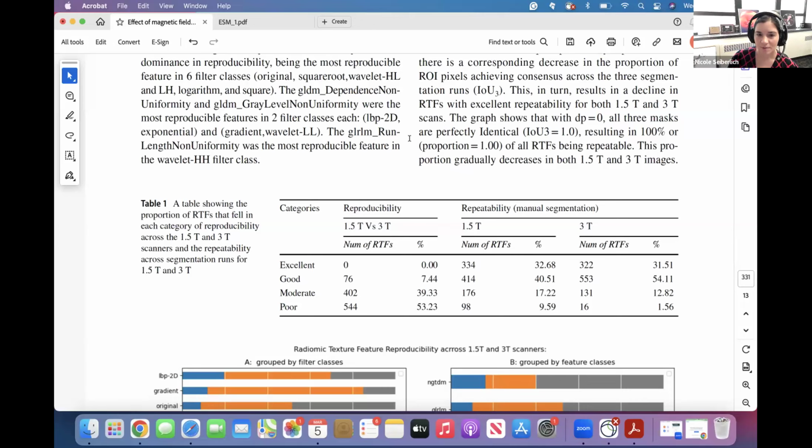So I think, just to make sure I'm understanding, the question is about the actual values, that the T1 values at 3T are going to be fundamentally different than the values at 1.5T. So did you have to think about how that would change what the values of the features might be? Can you come again? I think the question was less about resolution, but more about the fact that T1 values are much higher at 3T than at 1.5T. And so you might want to calculate the features in a slightly different way in order to make them more comparable. I think that was the question.